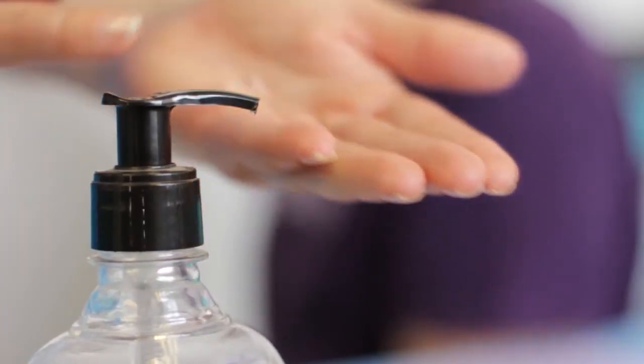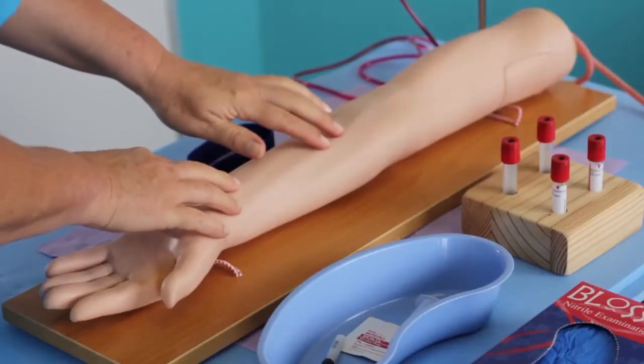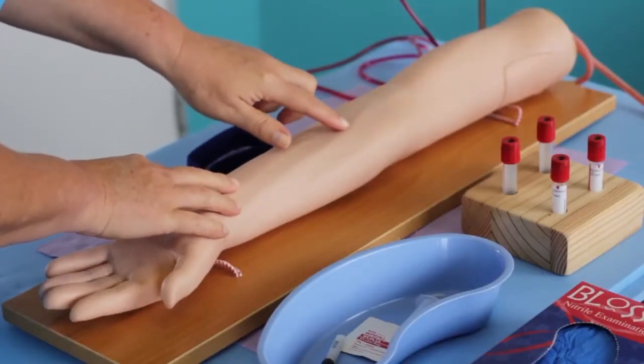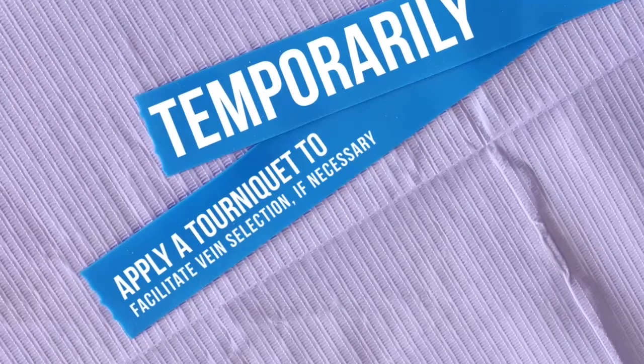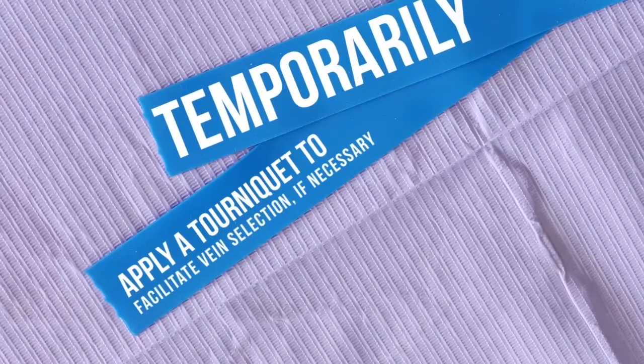Perform hand hygiene. Select the site by inspection and palpation, preferably in the cubital area. Temporarily apply a tourniquet to facilitate vein selection if necessary.